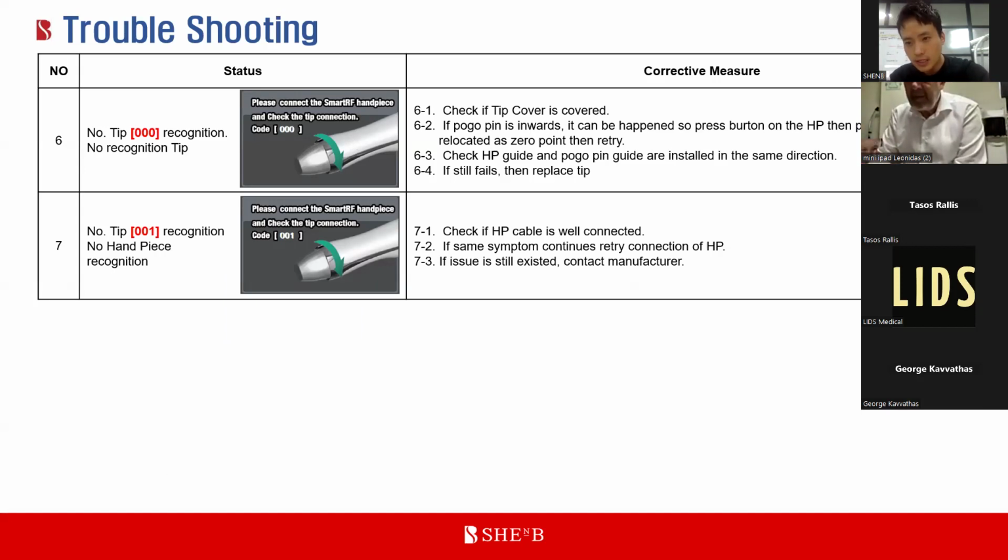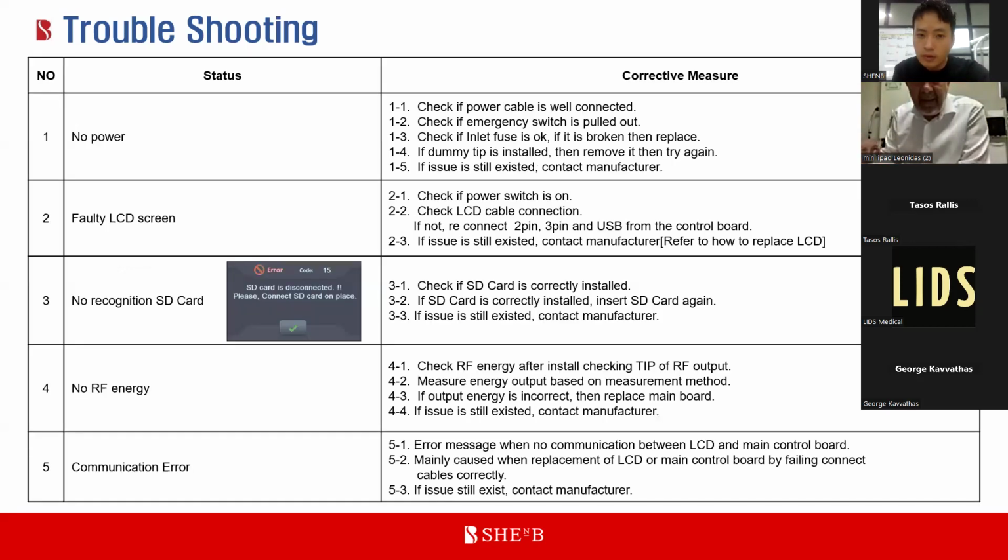So when we see, Steve, yes. Sorry to interrupt you, but I have one question that came from the previous slide. Okay. Regarding the error, no RF energy. Yes. You said that we have to check energy after installing and checking the tip. No. And we have to measure the energy out. I didn't mean. This is always a question that I had.